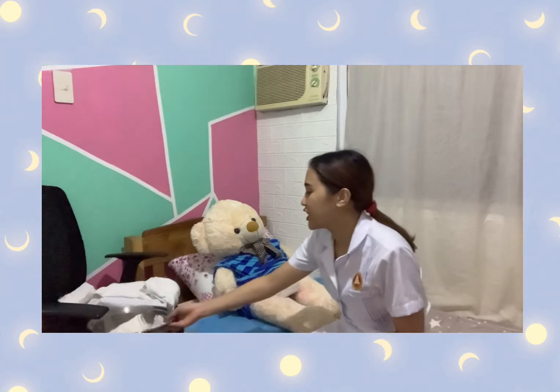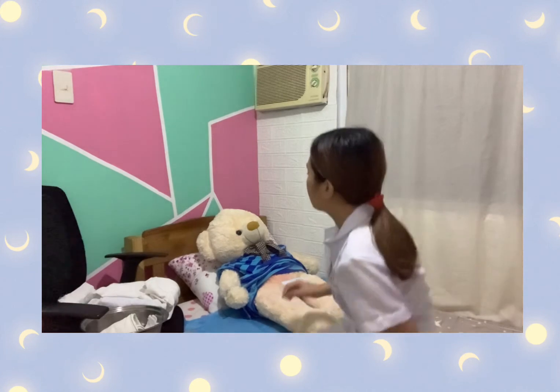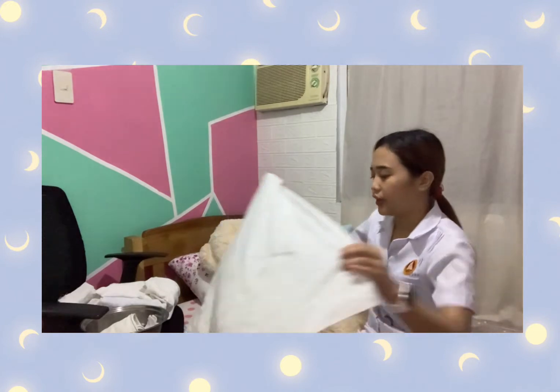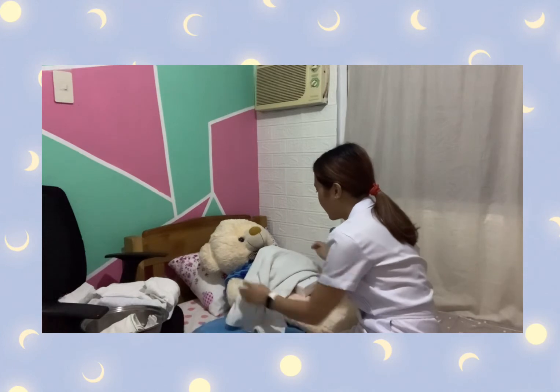After performing the perineal care to the patient, we will now position our patient. For female patient, we will position them into a dorsal recumbent position wherein knees must be slightly flexed and 2 feet apart. For male patient, we need to position them into a supine position. After positioning our patient, we can provide drapes for additional privacy and comfort to our patient. We will cover the other areas that will not be assessed.